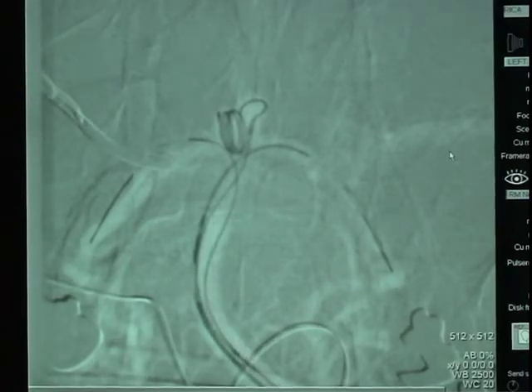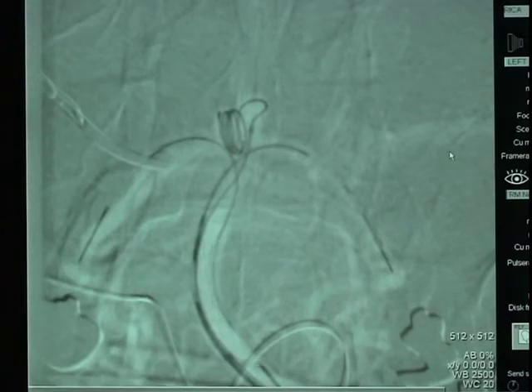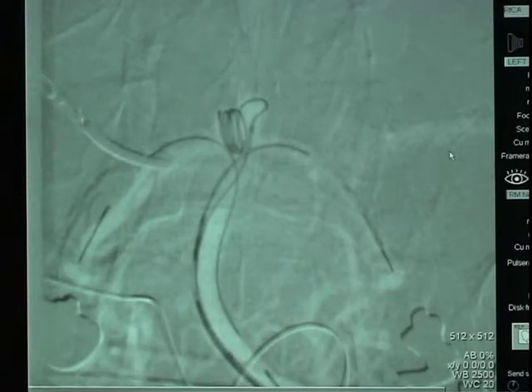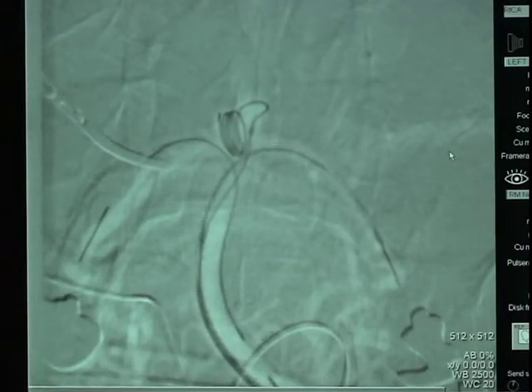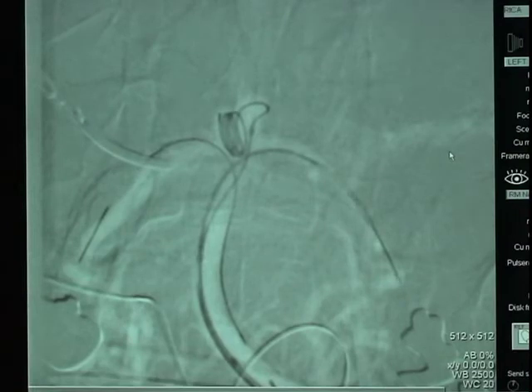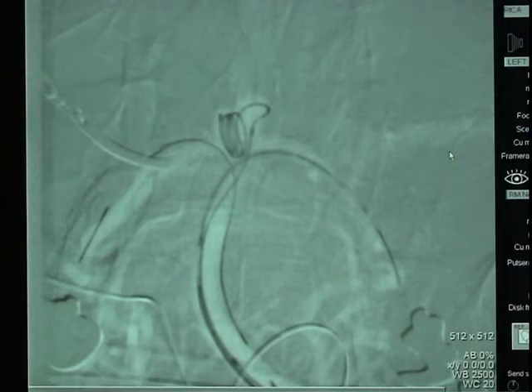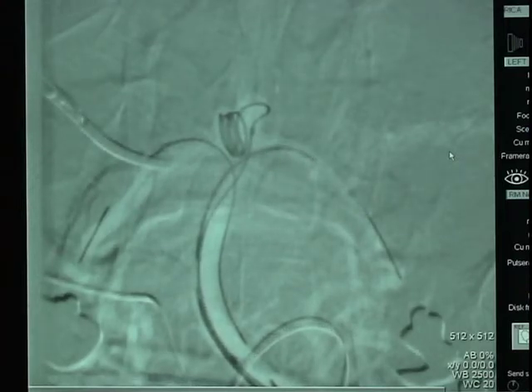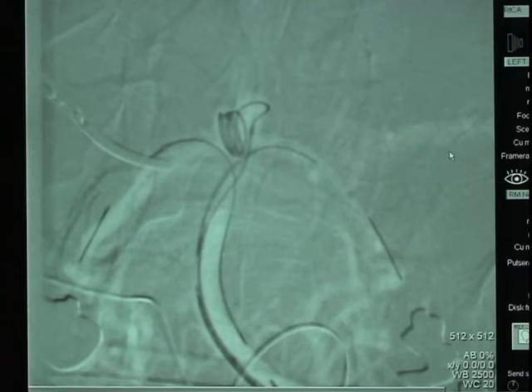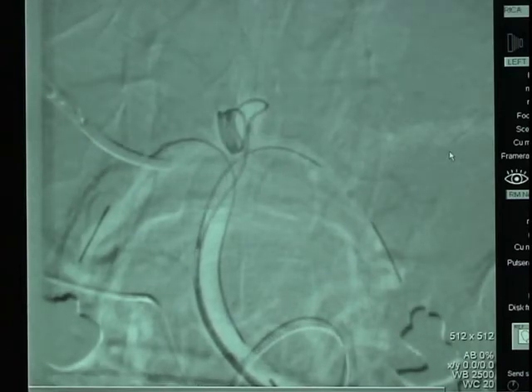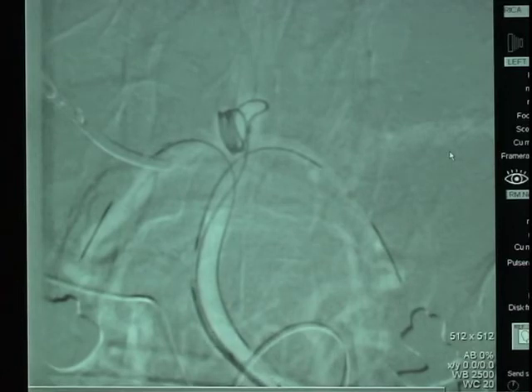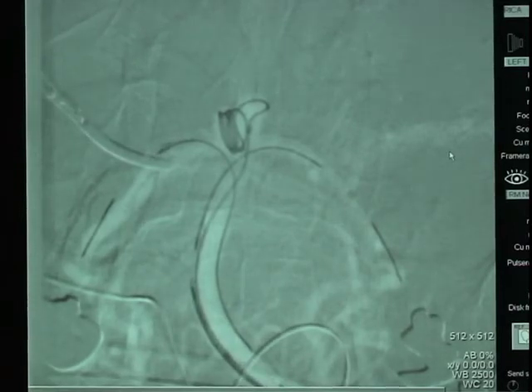It has been completely deployed. The second neck remodeling device is now deployed from the catheter so that it lies partially within the basilar artery as well and partially within the left posterior cerebral artery. This is our Y-stenting configuration. These stents themselves kiss one another within the basilar artery which they share.